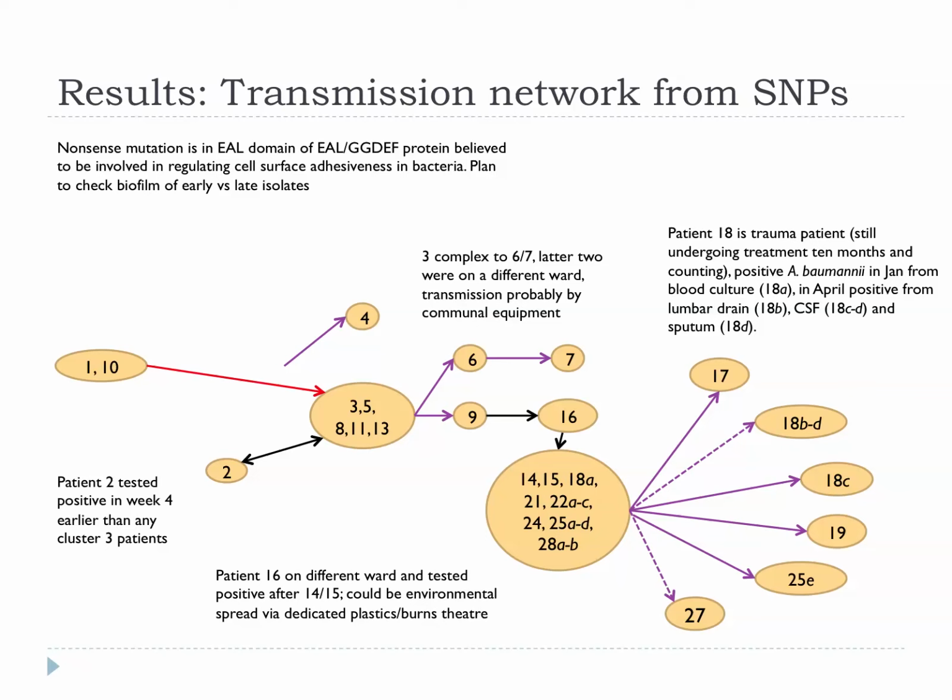One patient here, patient 18, we've sampled multiple times, still ongoing. That patient is still being treated in the hospital. But you can see that we have one of the isolates from that patient in this cluster, but we have a couple of other clusters coming out of that patient. And this is a lesson that we're taking on board.